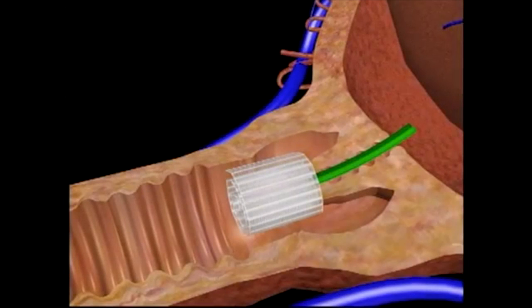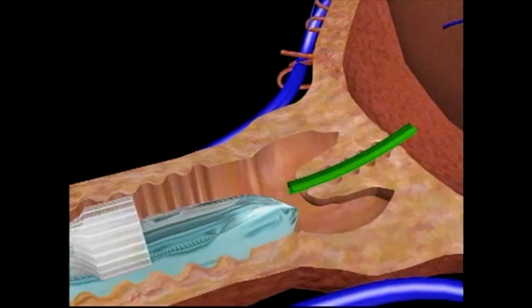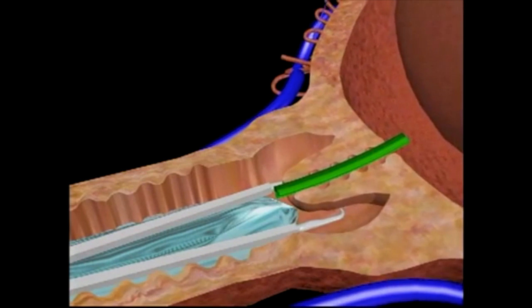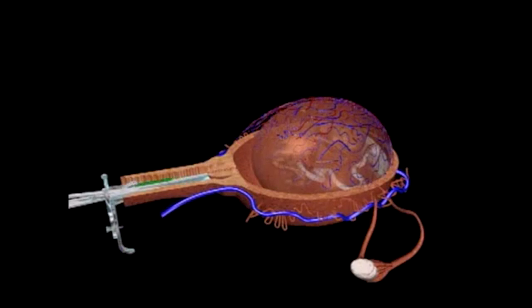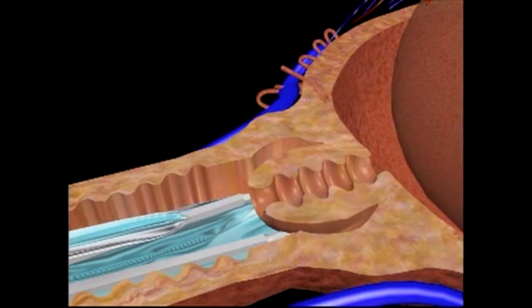After the stage of the dilation process has been completed, the speculum is again inserted and the gauze removed. The tenaculum is then used to pull the uterus back in line with the vaginal canal, and the laminaria is removed. Next, greater dilation is achieved with the same progressively larger cervical dilators used in the suction curettage abortion.